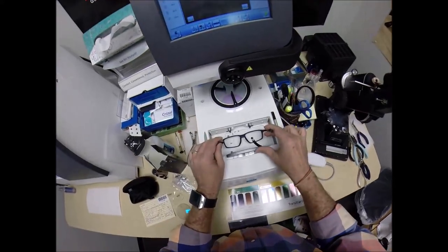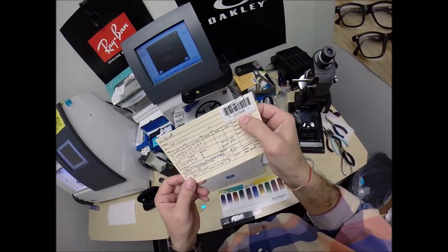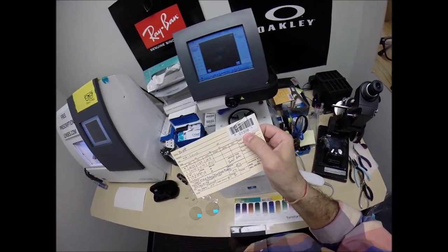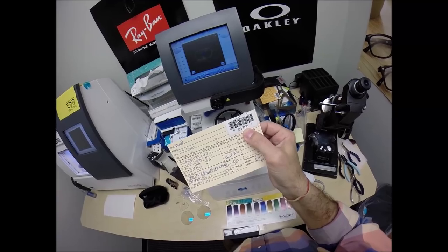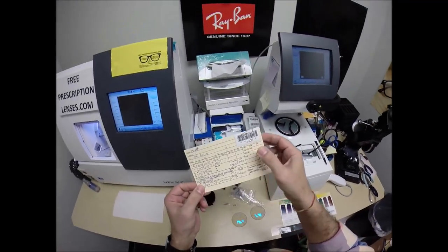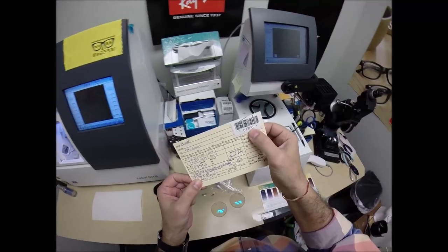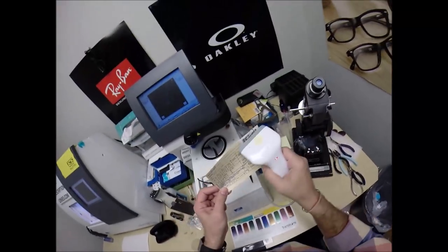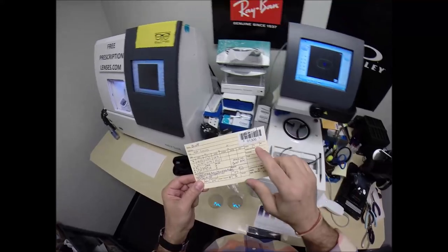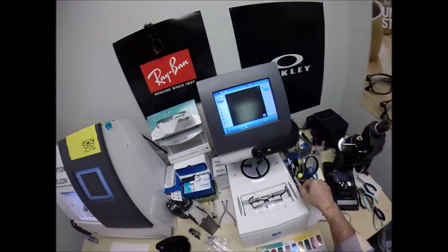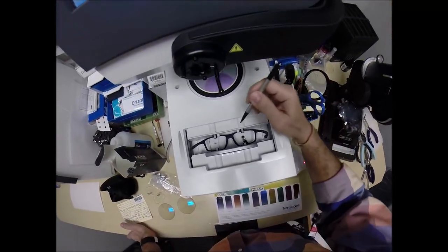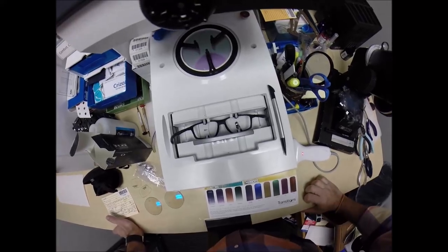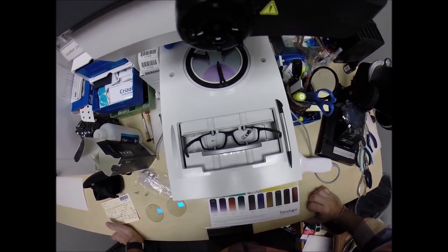I'm going to pop out the original demo lenses, put your frame into the tracing element of my blocker. I'm going to barcode the sticker. You are secret agent 1306. I'm going to hit the start button. The little stylus is going to pop up and trace the inside bevel of the right side of the frame before doing the same thing on the left.